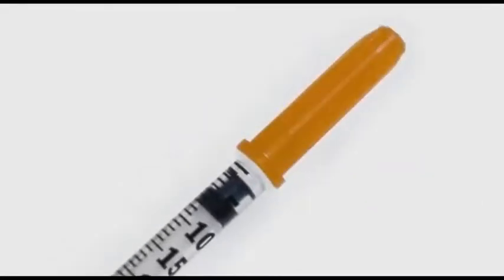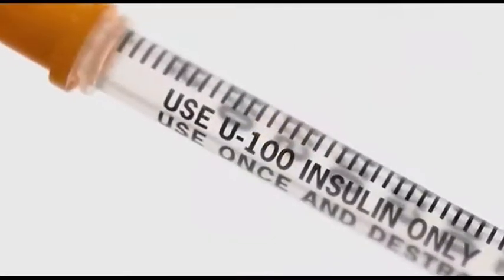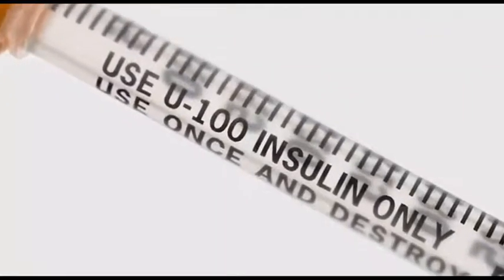Make sure your syringe has an orange cap and that the barrel is printed with U100 only. If your syringe doesn't have these features, it's not designed for insulin. Unless your doctor tells you otherwise, only use an insulin syringe.